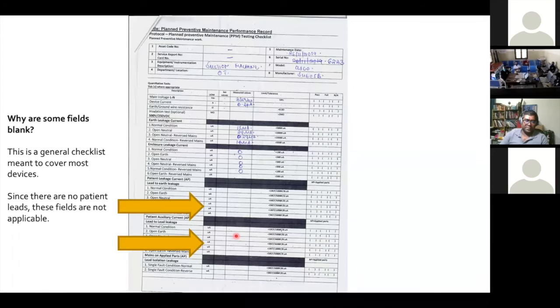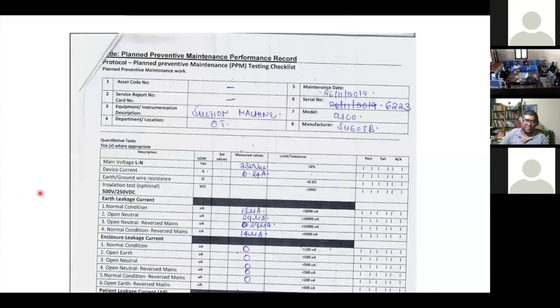Going back to verify: this standard checklist has some parts left unfilled — that's because suction machines don't have applied parts like patient monitors do. Patient monitors have leads that connect to patients; suction machines do not. That is why those parts weren't filled in. You must make sure you have this checklist.